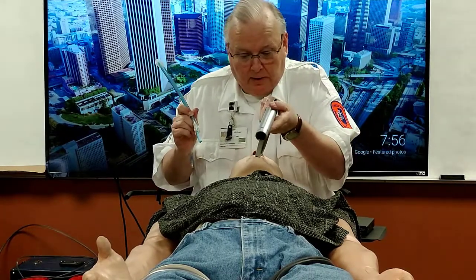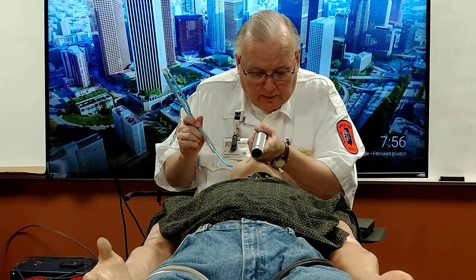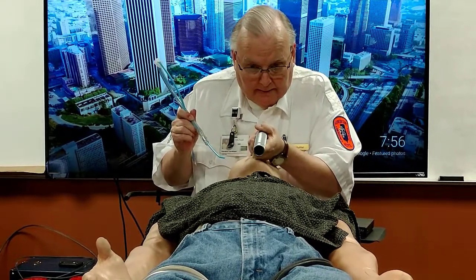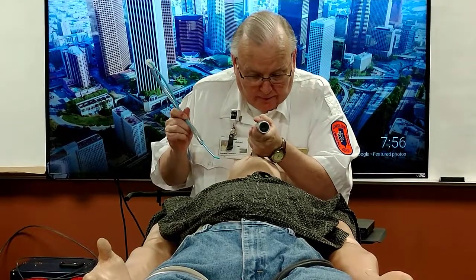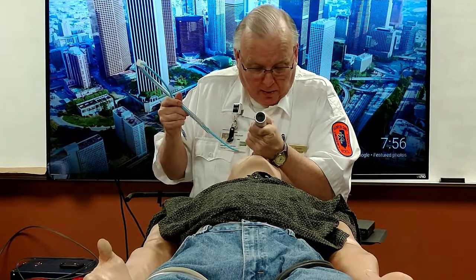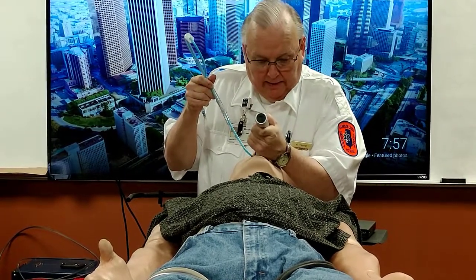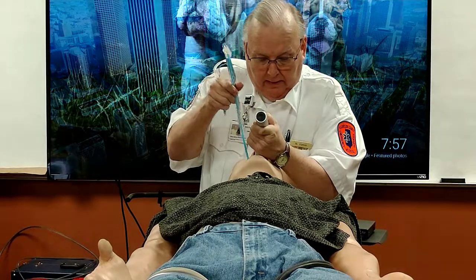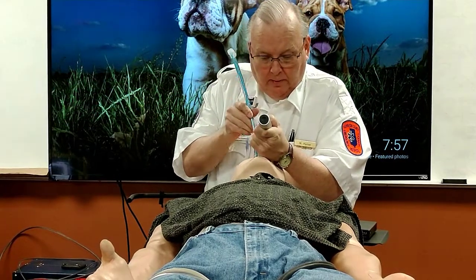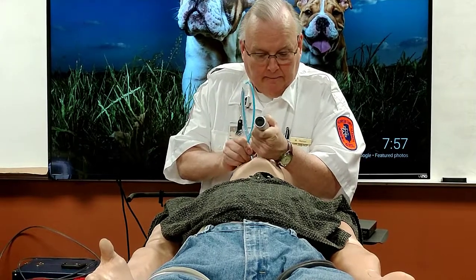Then taking our laryngoscope, we're going to progressively look for our structures. We're going to look for the epiglottis, the vallecula, the posterior cartilages, the arytenoid notch, and then finally the glottic opening and the vocal cords. We're going to introduce the bougie into the trachea.